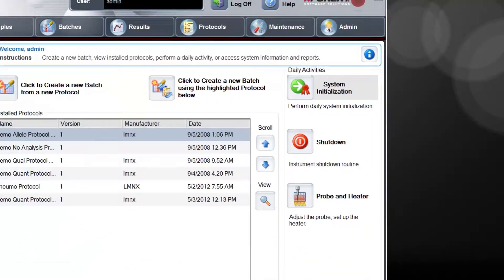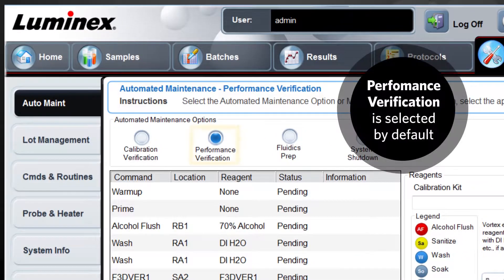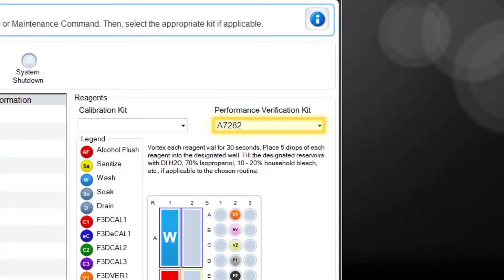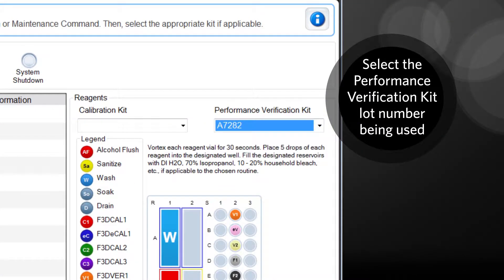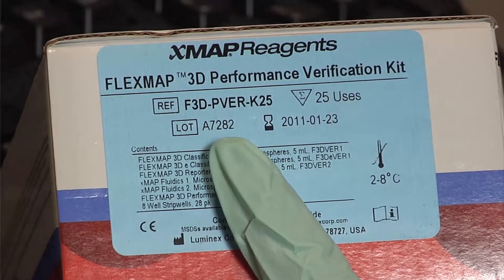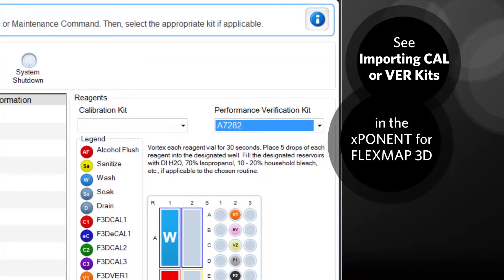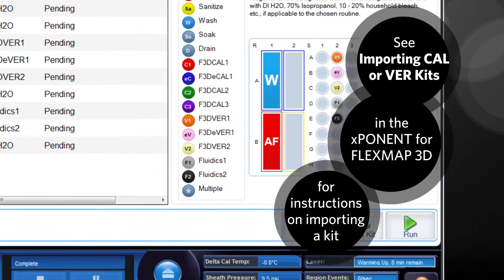This will take you to the auto maintenance tab on the maintenance page. The performance verification radio button will be selected by default. From the performance verification kit drop-down box, select the kit number you are using. This number is located on the reagent vials and performance verification kit box. Note: see importing CAL or VER kits in the Exponent for FlexMap 3D Software User Manual if you have not imported any performance verification kits.